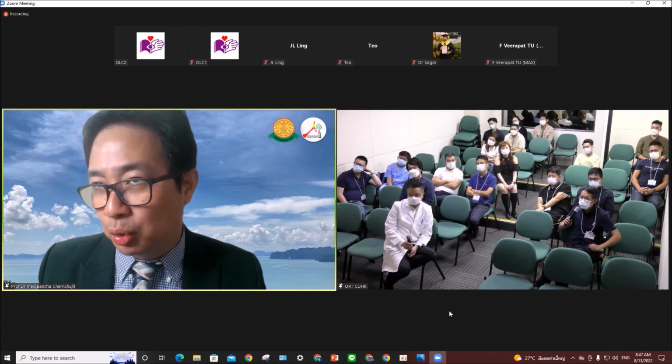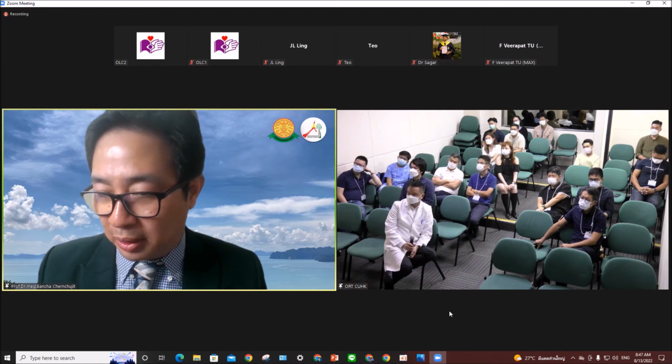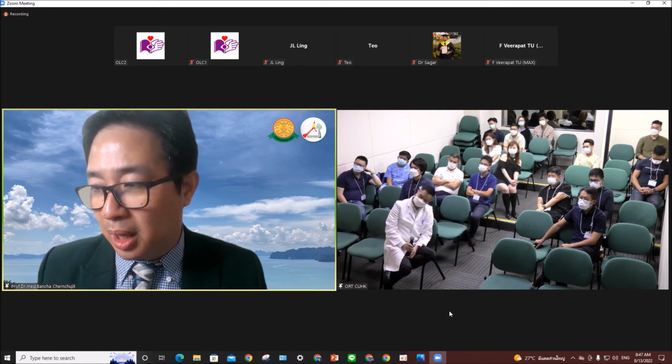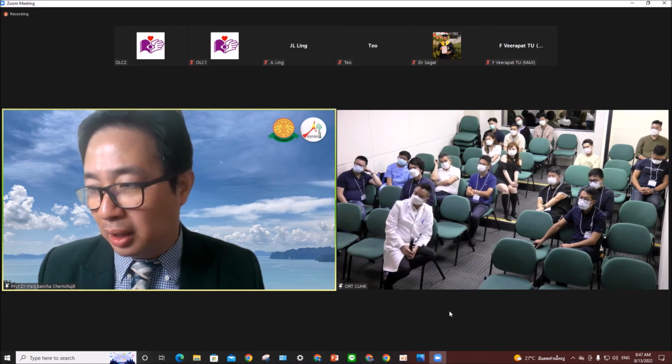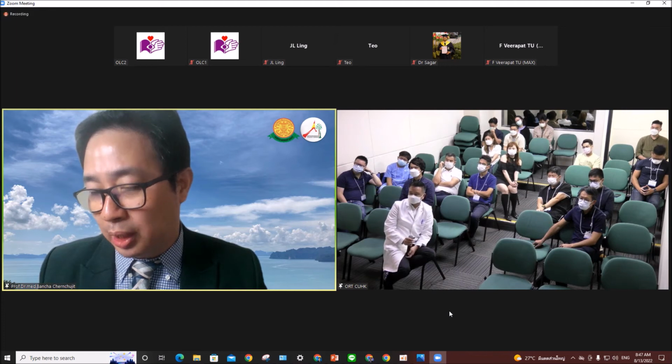And don't need to do the fancy way. Okay, I saw many literatures, they try to make double row anchors, but for our Asian size, sometimes it's not easy. And these two anchors may be jamming, right? So I think I follow Sugaya technique.